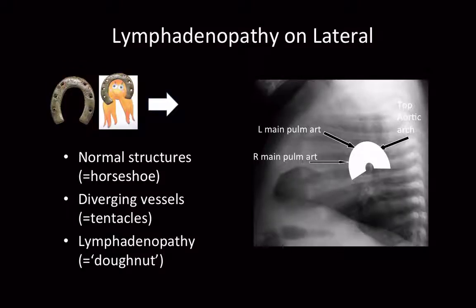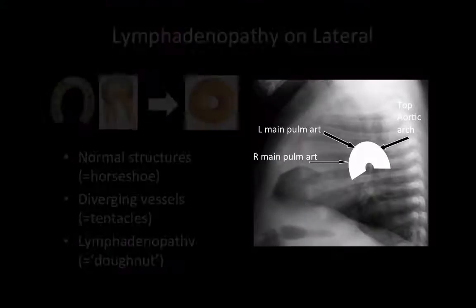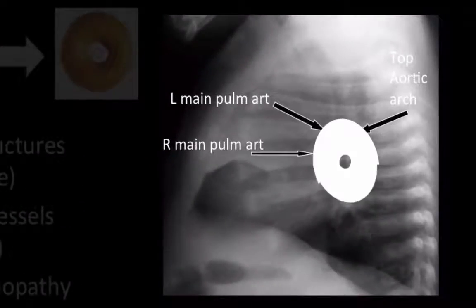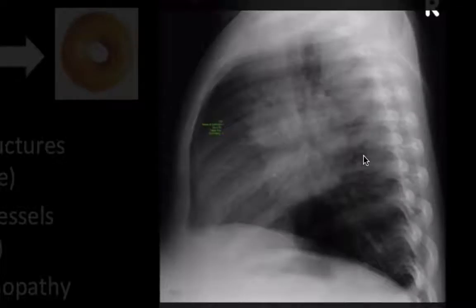The lymphadenopathy you will see on a lateral x-ray simplistically looks like a donut. That's what it will look like on a lateral chest radiograph. I'm going to show you with an arrow — it's really the bottom parts that you can confidently identify as representing lymphadenopathy.